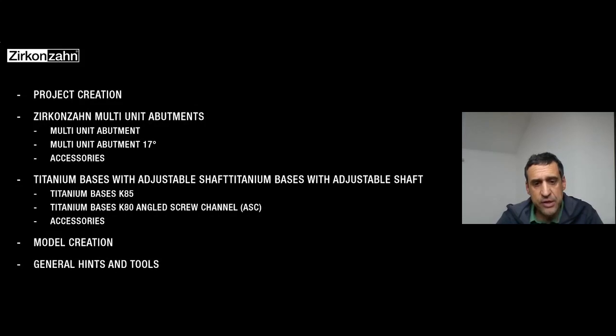We will speak also, and I will show you, tools and accessories that you can find in Zirkonzahn and buy just to manage everything in a much simpler way. And we will speak also about these new T-bases, as I mentioned already.